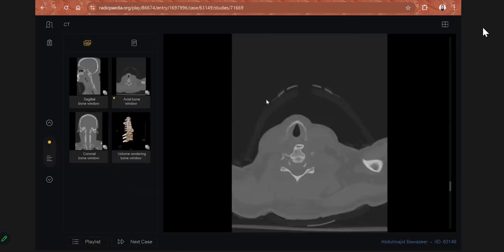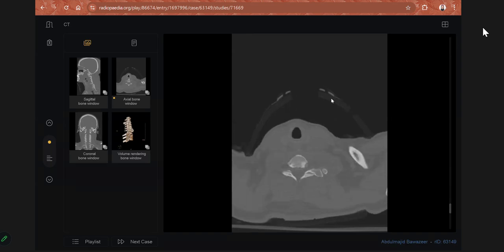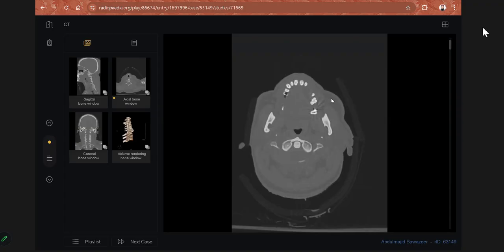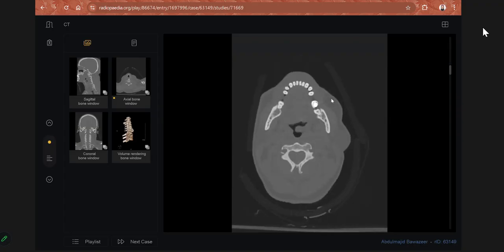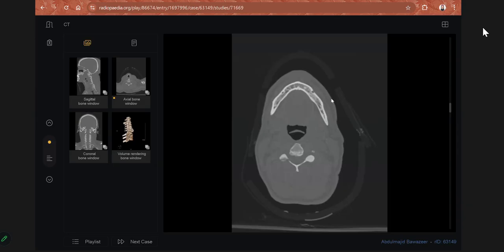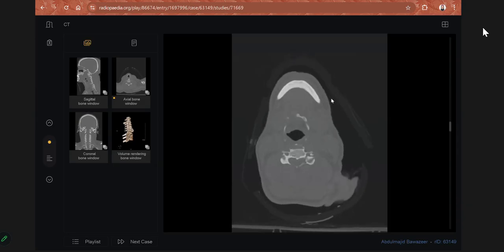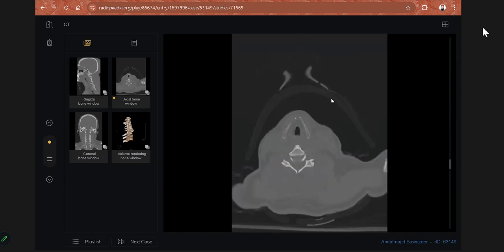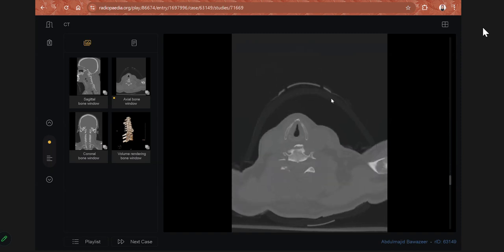So this is your next case. Okay, sir. This patient presents with a history of trauma, A&E. Yeah, over to you. Okay, sir. Sir, I want to scroll from the top to the bottom. Okay, then sure. I'll give my opinion. Now I'm scrolling from the start. I'm provided with CT spine images, axial view. The patient presented with a history of trauma.